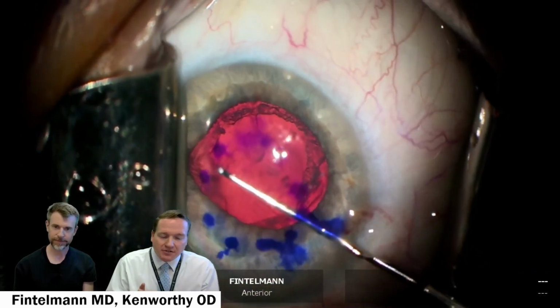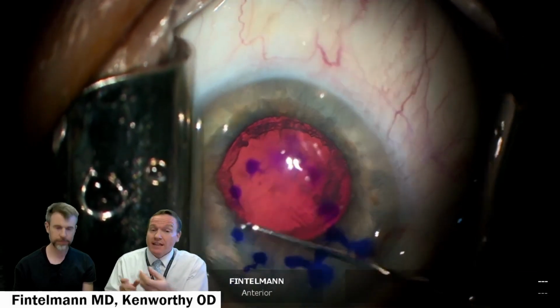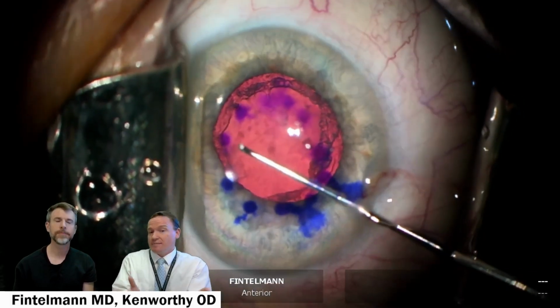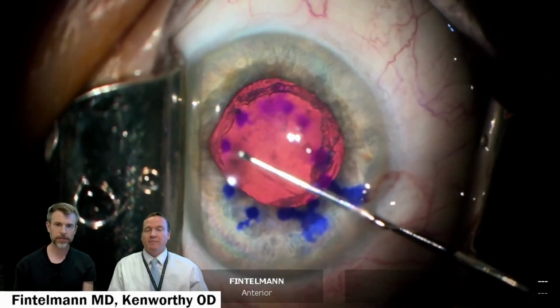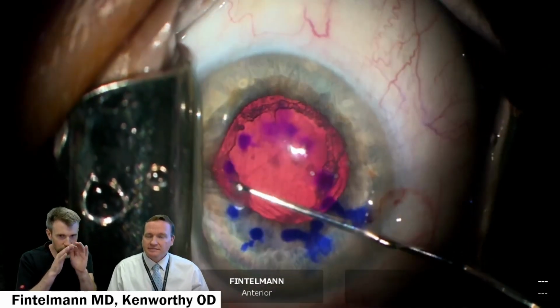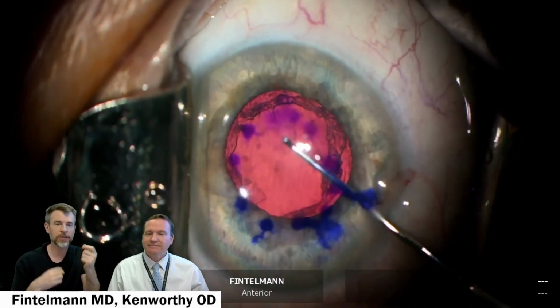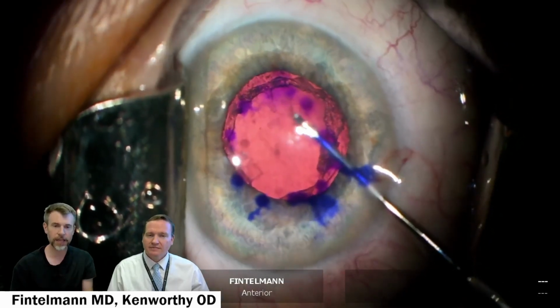Well, that care is so essential too, because I think when we think about the stroma, if there's any defect in the actual corneal stroma, now we're leading to something that's going to cause a scar, a permanent scar for the patient. Correct. So I only want to go through the endothelium, not through the stroma. So I just apply enough pressure to go through the endothelium, but not cause any fibers or tears to the stroma. Hence this care and time spent on this.